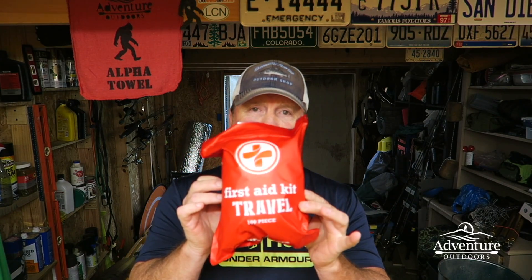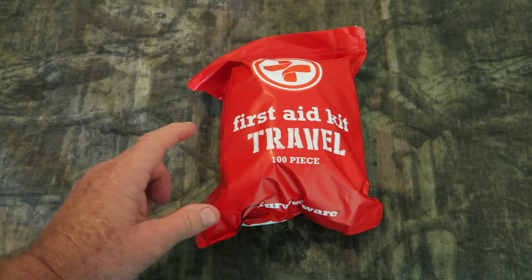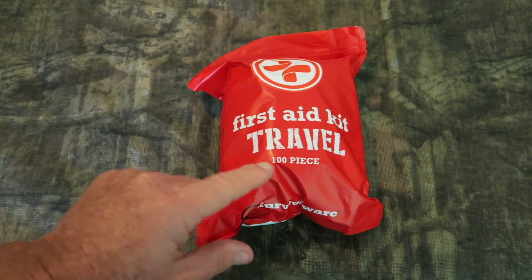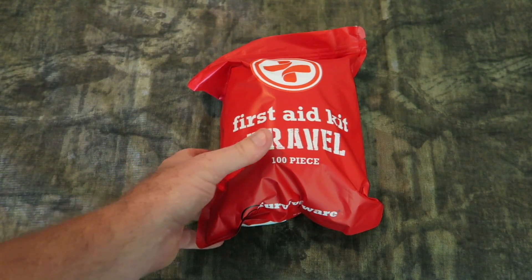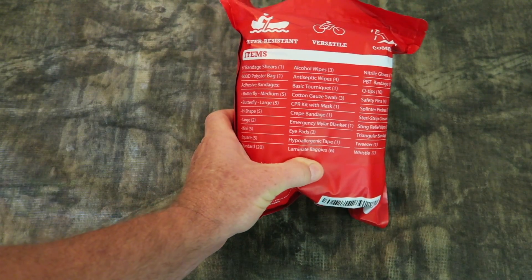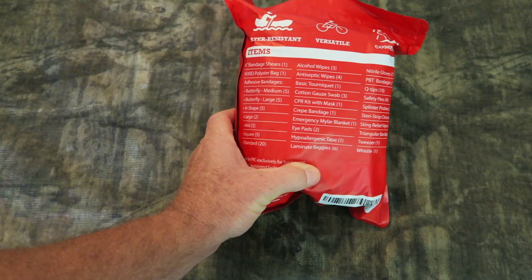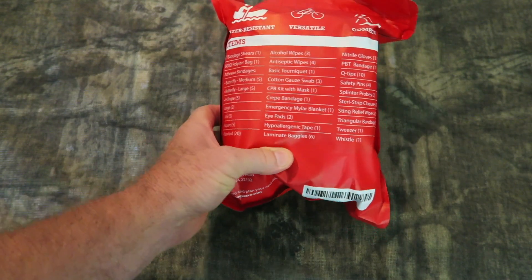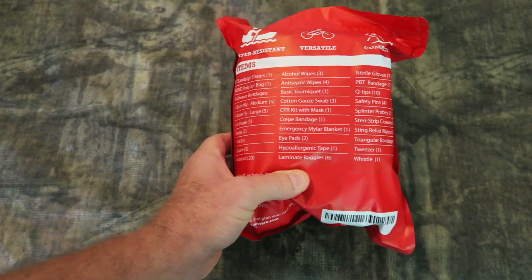The SurviveWare small first aid kit and also the SurviveWare large first aid kit. Let's open up the small first aid kit. It is listed as a 100-piece kit. It's inside some type of a plastic bag. If we turn it over, we'll see all of the items listed. There is a lot of stuff in this little pack.